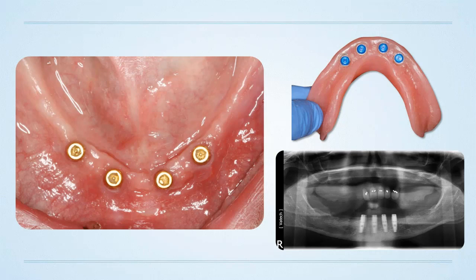And what happens here is that if you can go ahead and execute on this with a guided surgery, you don't even really need to be that crazy about finding the mental foramen. Now, asterisk, asterisk, asterisk, yes. If you're doing guided surgery, you still need to feel comfortable with everyday implant surgery. So guided surgery is not a crutch for surgery. You still have to feel confident with your surgical skills. However, it does give you the leverage of being able to do more advanced cases.